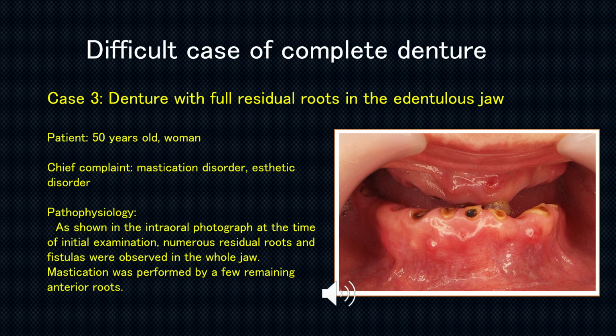Case 3. Denture with full residual roots in the edentulous jaw. Patient, 50 years old, woman. Chief complaint: mastication disorder, aesthetic disorder.